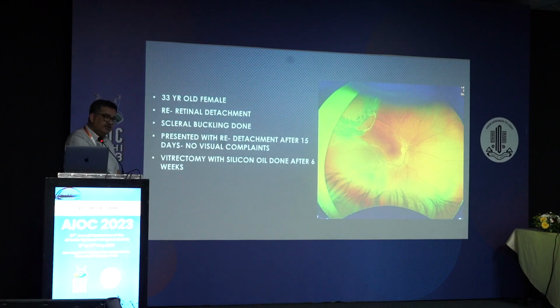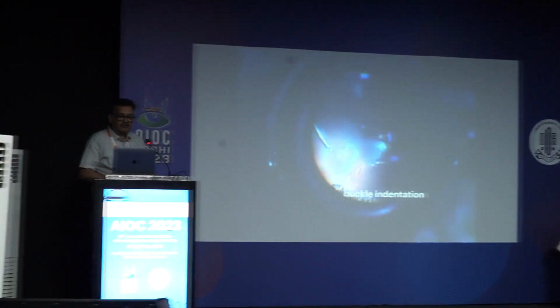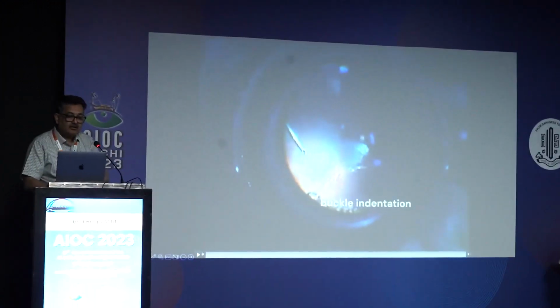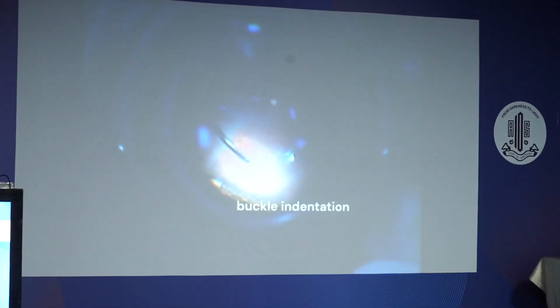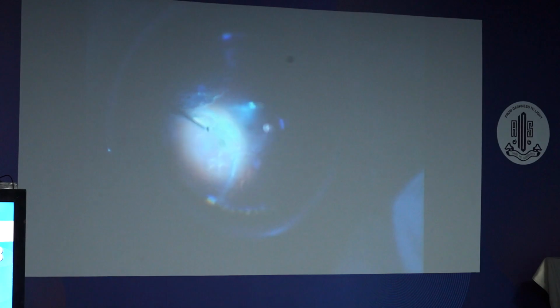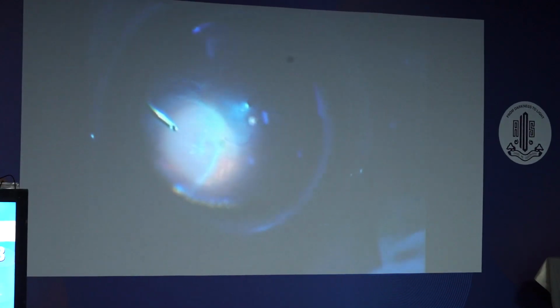So it drained, the retina settled, but after a few days the fluid came back in the same location. Now I'll show the video where I first indent. You can ask me to stop the surgery at any place. So I'm indenting and trying to look for a break. This is suspect.